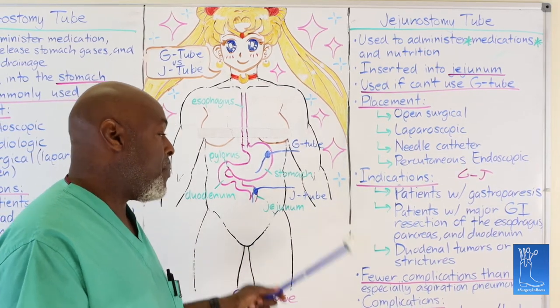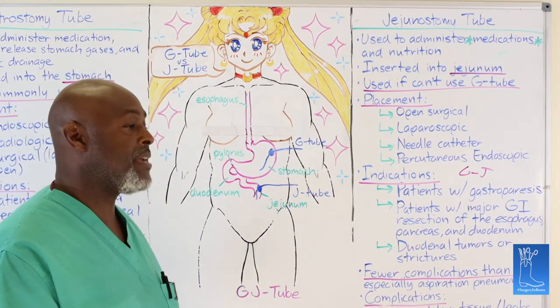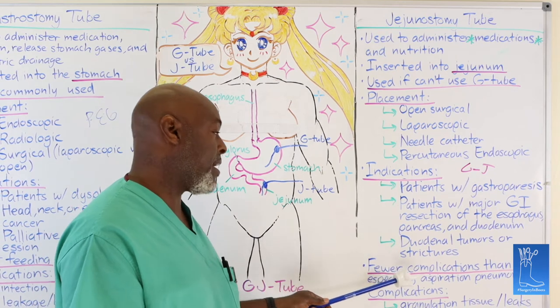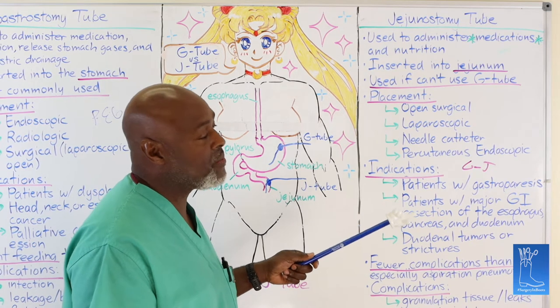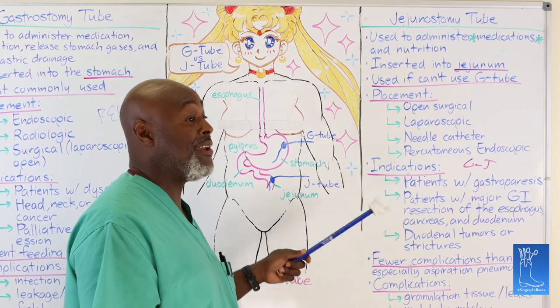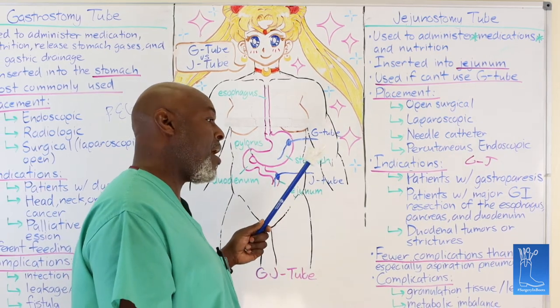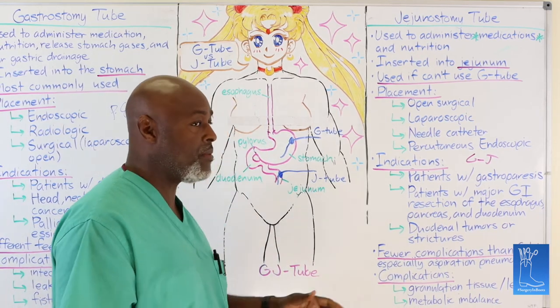Now, it has fewer complications than a G-tube. When you're thinking about aspiration pneumonia, when you're thinking about complexity of tube feedings, because you have different options with a G-tube and you don't with a J-tube. So I would not say fewer complications, I would say simpler complications. And it is fewer, but it's really just because of the number of things that can go wrong. A J-tube, it either works or it doesn't work. If it doesn't work, you gotta figure out why. G-tubes can erode into the stomach, they can get pulled a little too tight, they can leak, get free air. All of that stuff doesn't happen with J-tubes because they're just simple. Put them in the small intestine and let them work.